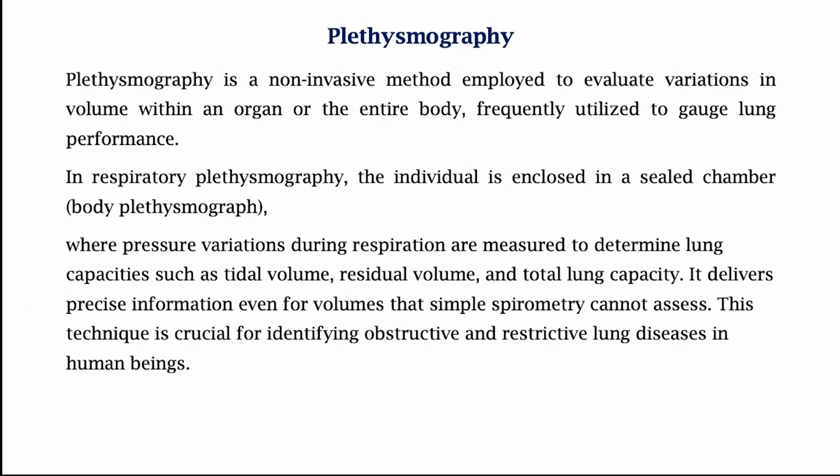Then the pressure change is essentially by how much? P1V1 is P2V2. Let's say I can measure the initial pressure and the final pressure, and I know one of the volumes is constant. Which volume is this? This is the phone booth volume. Then I could compute V2 essentially as P1V1 divided by P2, assuming that I am able to make a relatively accurate measurement of P1 and P2. And because P1 does not change, the P2 change is happening essentially due to V2.